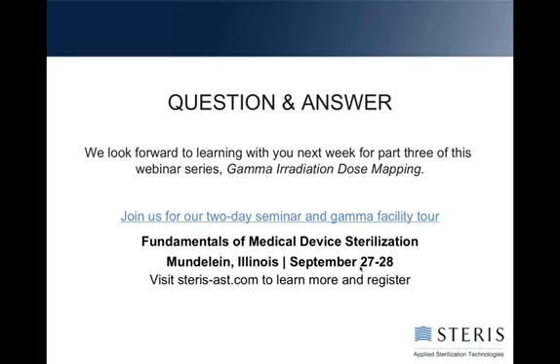Okay, is it possible to augment a dose established with VD max 25 when the average bioburden is greater than 1,000 CFUs, or would another method need to be used? Okay, augmentation is done when the sterility test fails, not when one sample was higher than 1,000 CFUs. You, of course, can always augment your dose.